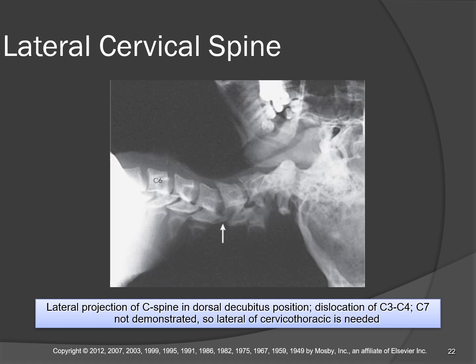Okay. Yeah, that is fragile. You don't need to be doing manipulations. This patient needs to be in a collar until a fixation can be performed.